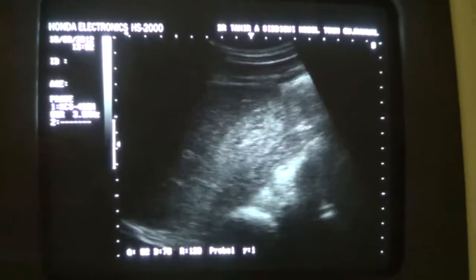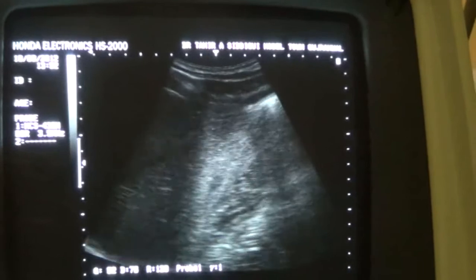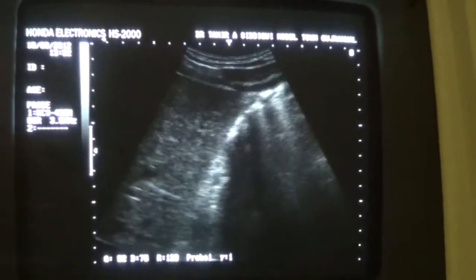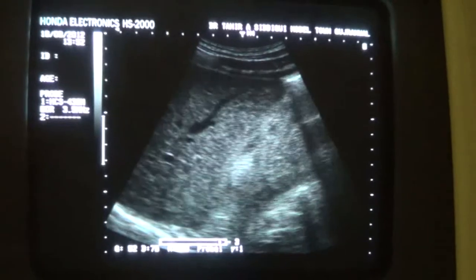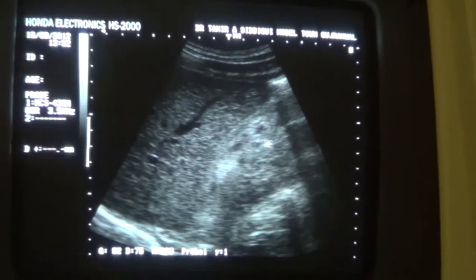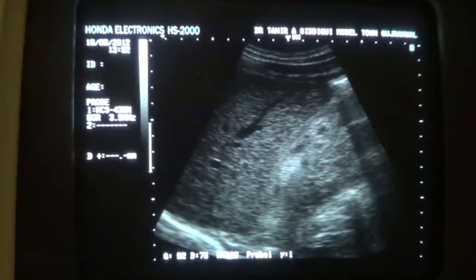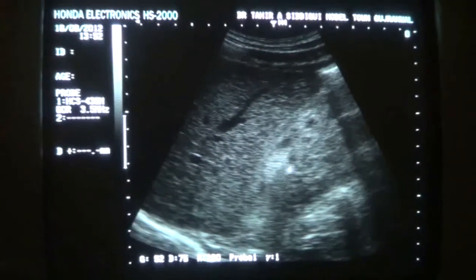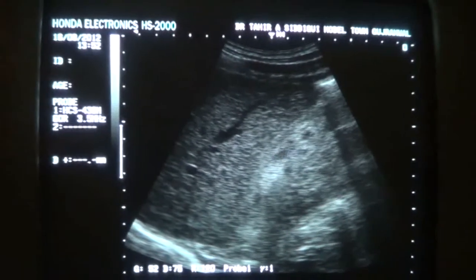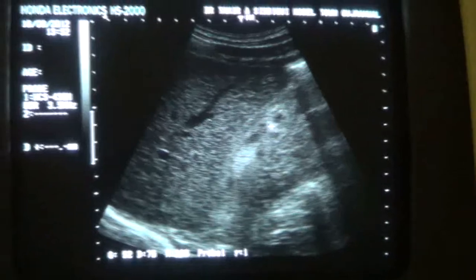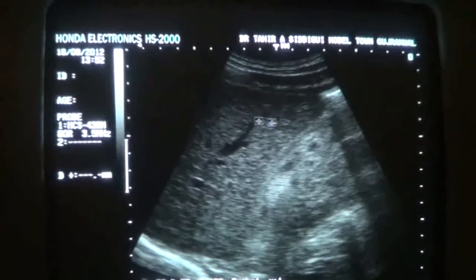Now let's examine the tissue of the kidney. The renal cortex is thinned out — that is finding number one. Number two, the thinning of the cortex. These are a few specific areas: the medulla. And there is no central sinus echo complex fat seen. Note that the echogenicity of the renal cortex is significantly more as compared to that of the normal liver.